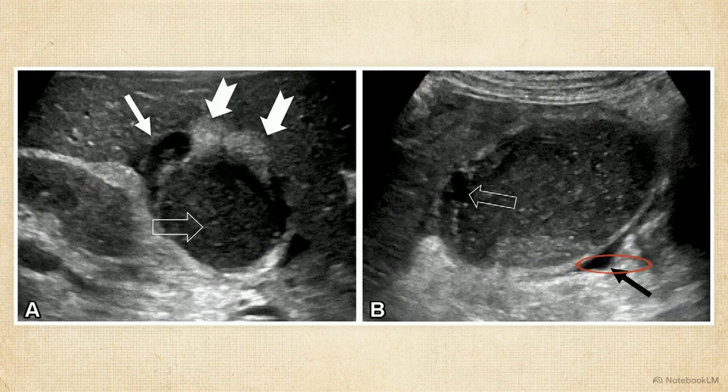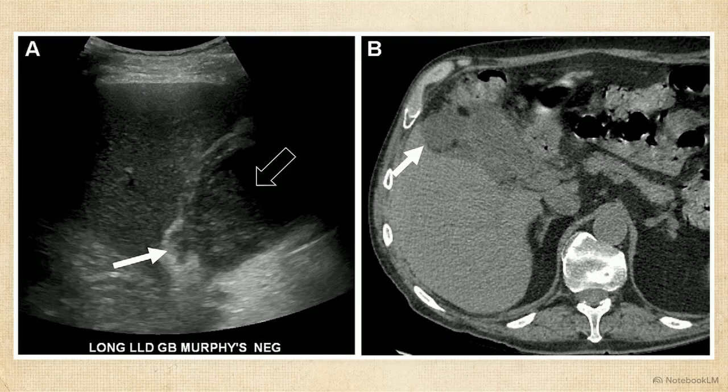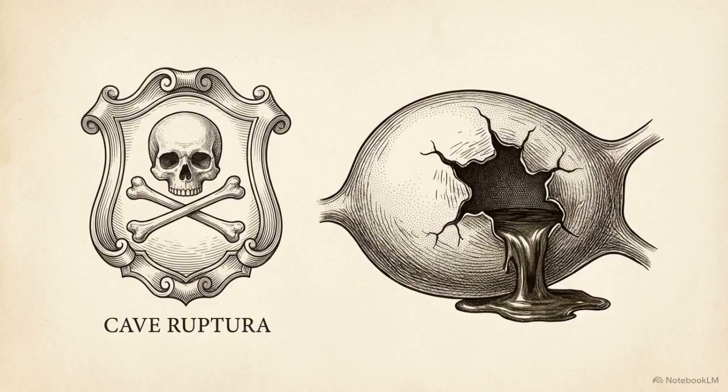There is a specific clinical scenario where the gallbladder's appearance becomes highly deceptive: post-perforation decompression. As bile leaks through the rupture, the gallbladder deflates. Look at this ultrasound of a perforated organ. The extrusion of contents decompresses the lumen, instantly erasing the high wall tension required for a tensile fundus sign and eliminating the distension that triggers the Murphy sign. In a critically ill patient, a negative Murphy sign does not guarantee a healthy gallbladder. It can indicate a dangerous perforation that has already decompressed the organ.